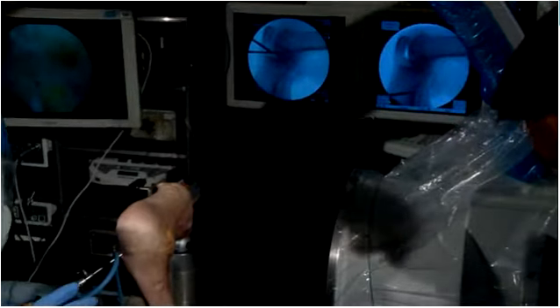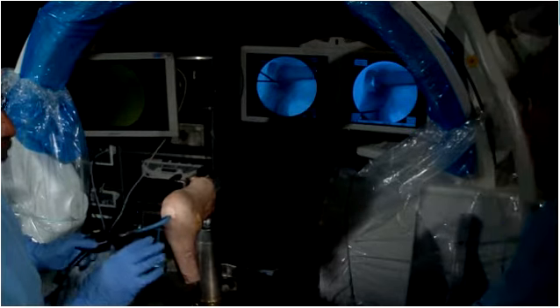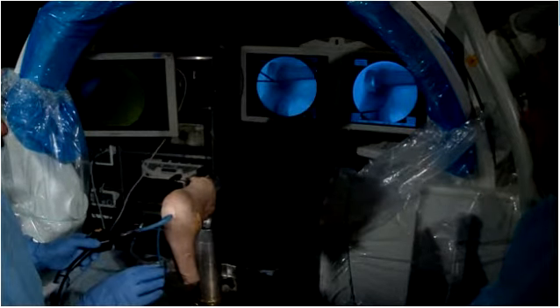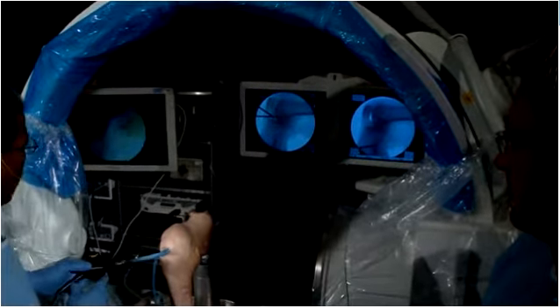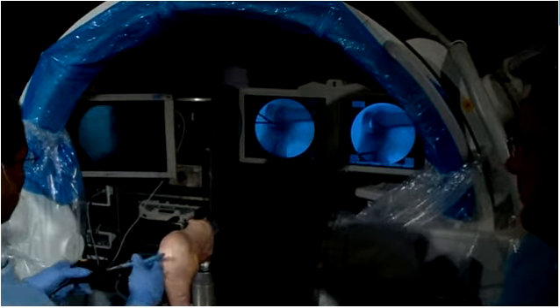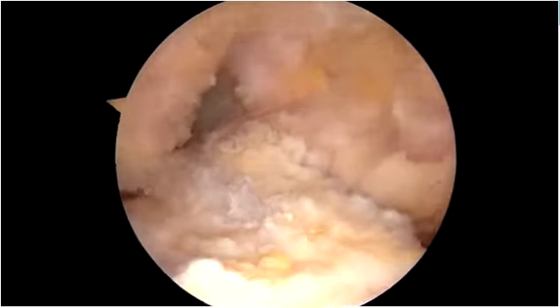Okay, so those are the landmarks we use and the drawings. And what I'm going to do is show you the ACL. I do use fluoroscopy on every ACL. I've been doing it since 2006, and I do think it helps you as a surgeon. So can we go to the inside view? Do we have an inside view now? Do you guys have an inside view?